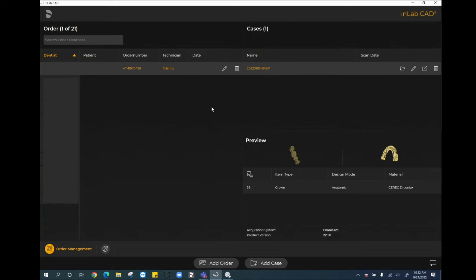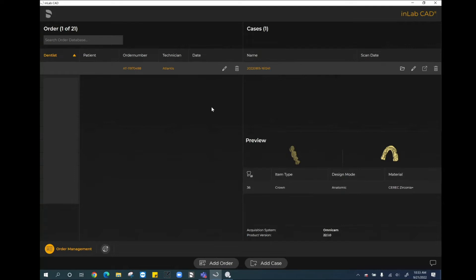This is specific to a Dentsply Sirona ecosystem, meaning that the file type needs to be something generated from our implant planning software known as Sidexis, or the old software might be known as Galileos. The type of file that we need is known as a CMG.DXD, an implant planning file that comes from Sidexis. If you do not have this, if you have something like a DICOM file, that does not work in the InLab or CEREC software. It does need to be part of the Dentsply Sirona ecosystem.